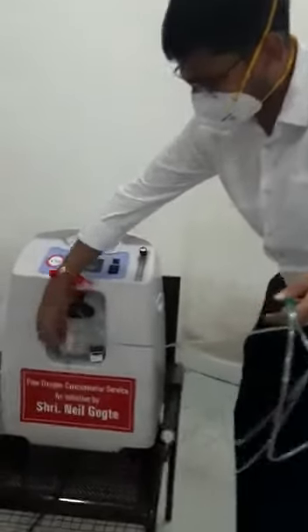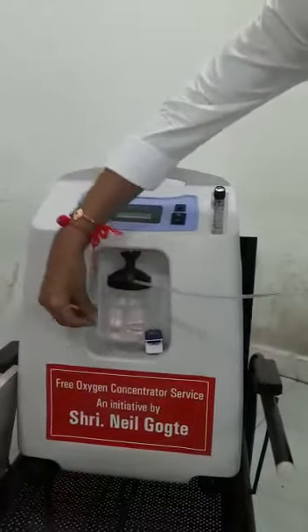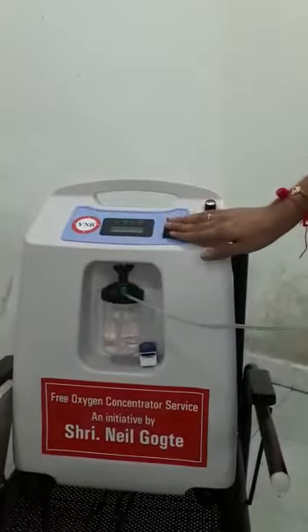There is a small chamber. You have to fill it half with distilled water or filtered water, so that the oxygen that comes through is humidified — not dry oxygen but humidified oxygen. It will not cause any cough to the patient.